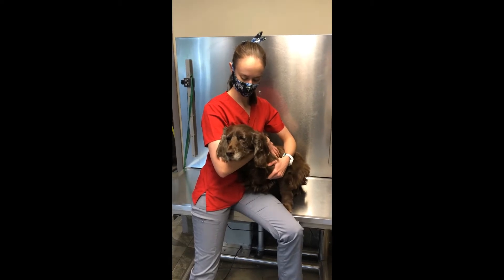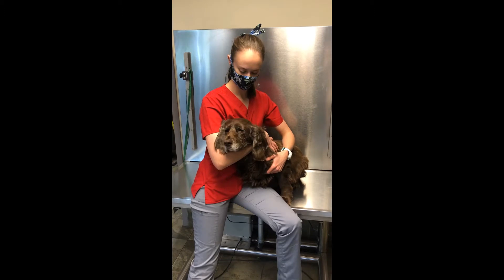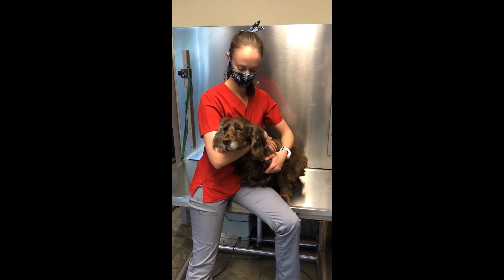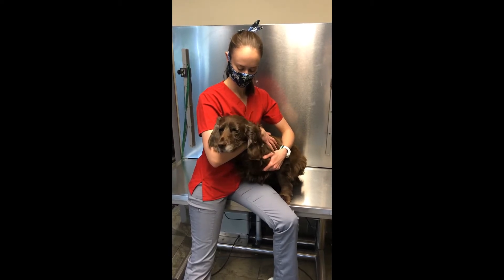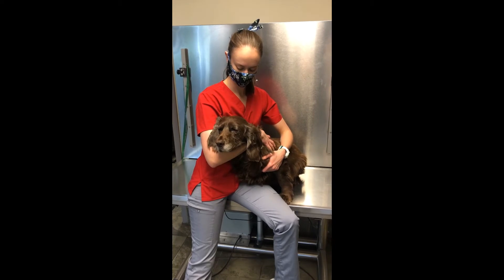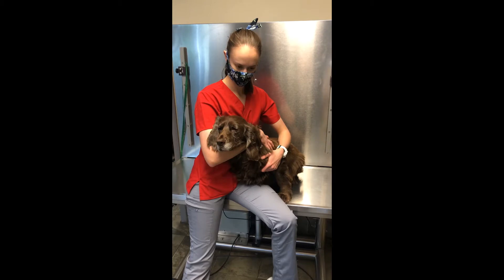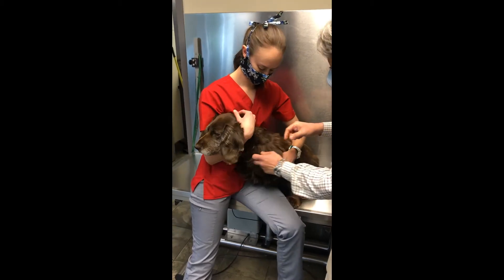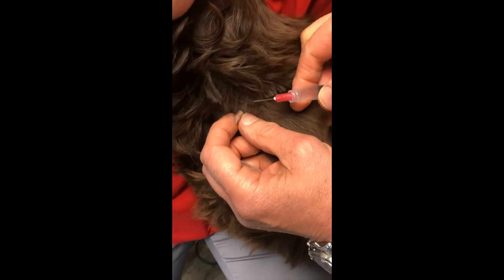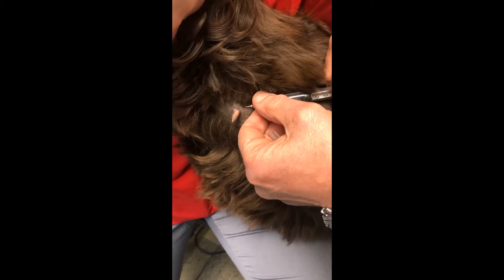We're here this afternoon to do a cryo pen on Nati. Nati is a 10-year-old English Spaniel and she has two masses that are cutaneous in nature yet benign — one is on her left cervical region, the other is on her right mandibular labia. We're going to put a little lidocaine bleb under each of them. I find that it's not necessary, but she's a somewhat fractious dog.